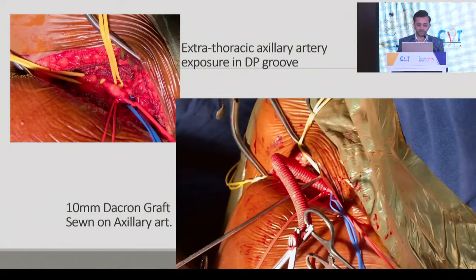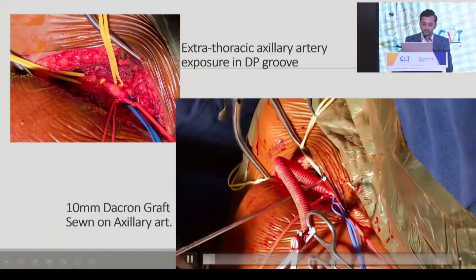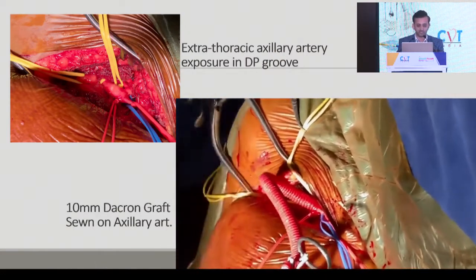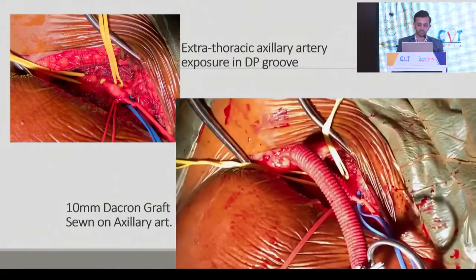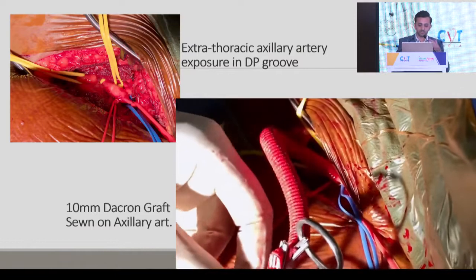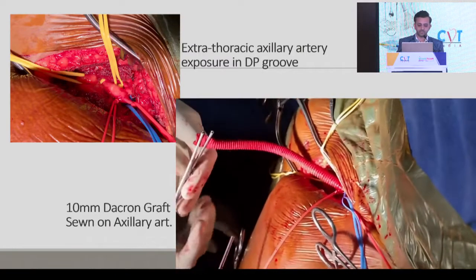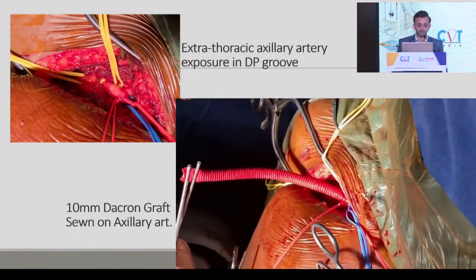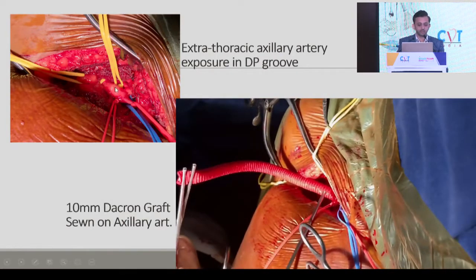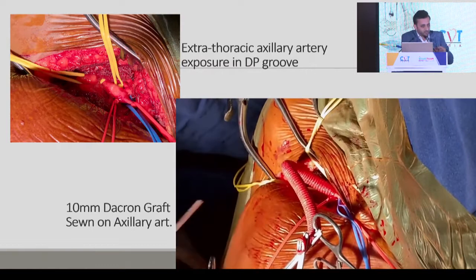So I said, great. So this is a video. This is a Dacron 10 millimeter graft, which is sutured on the axillary artery in a bevel shape, making sure that it does not create any narrowing. You can see the pulsations. This is the Dacron graft, 10 millimeter, which is sutured somewhere over here. So now I'm working outside the chest cavity. I'm not working very deep.